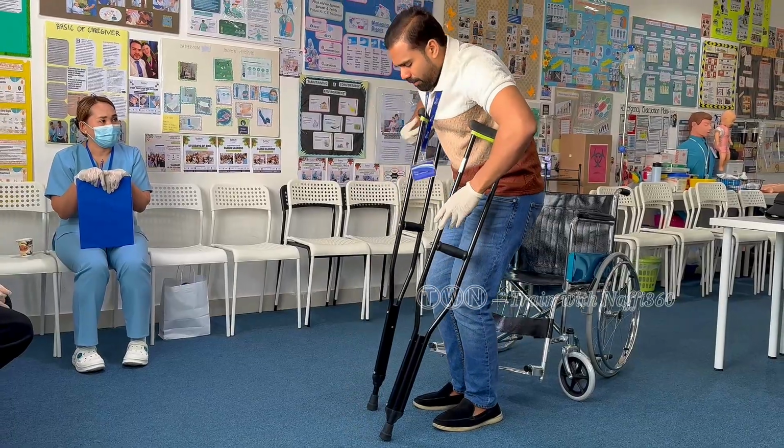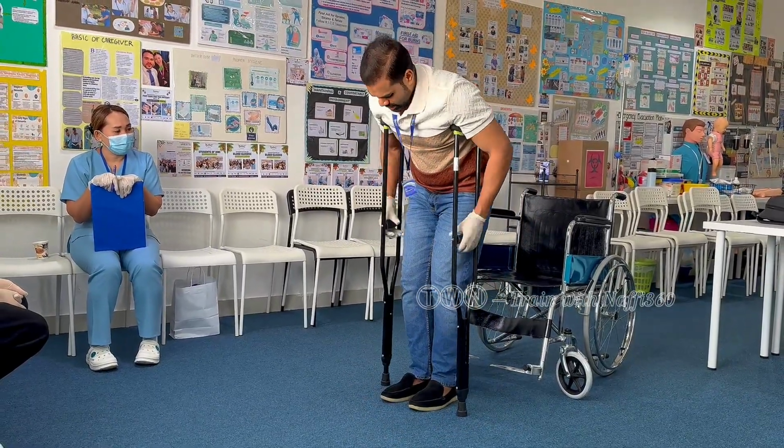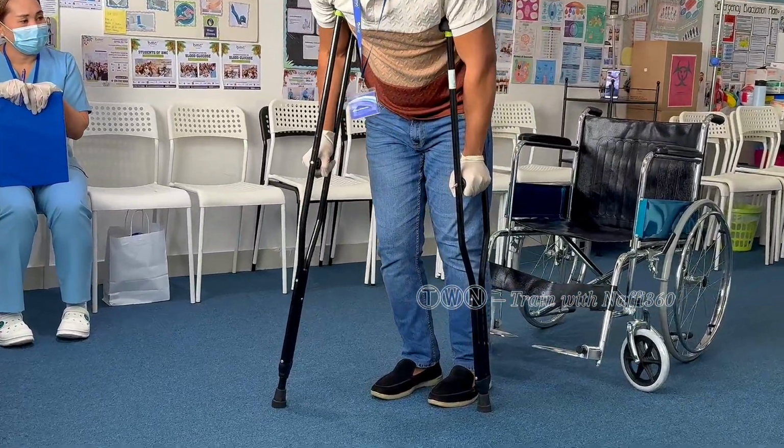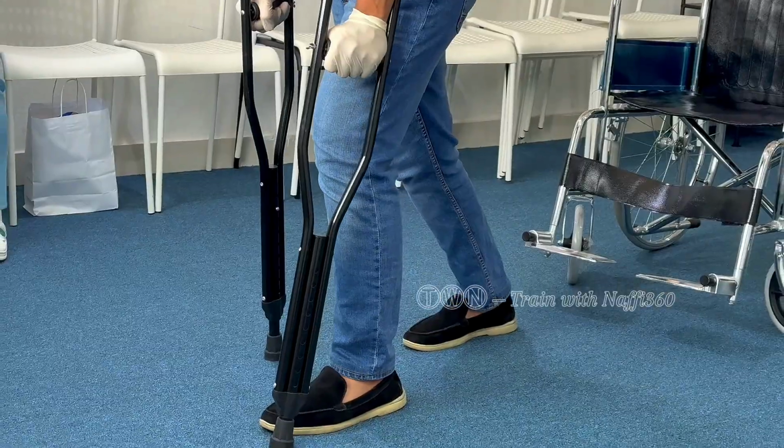Encourage the patient to keep their eyes looking ahead, not only at their feet. This helps to maintain balance and prevent injuries or accidents. Remind the patient to avoid rushing during this process.